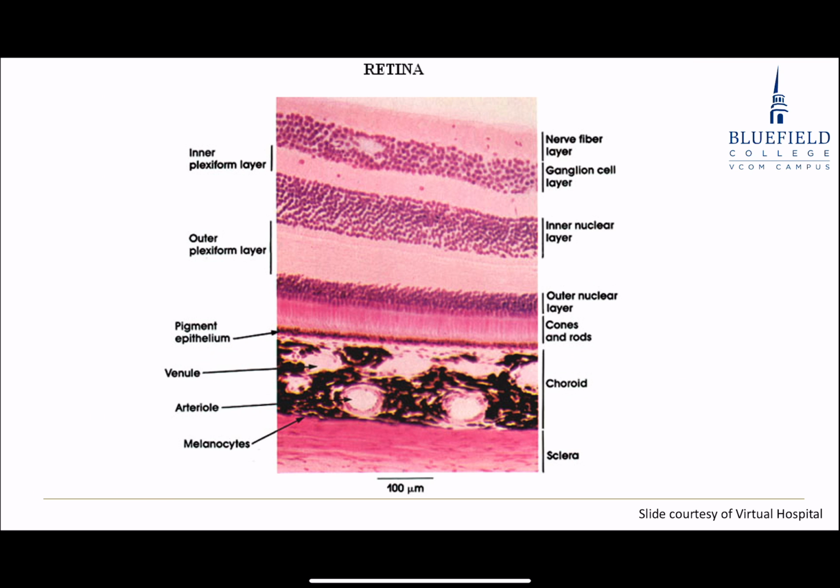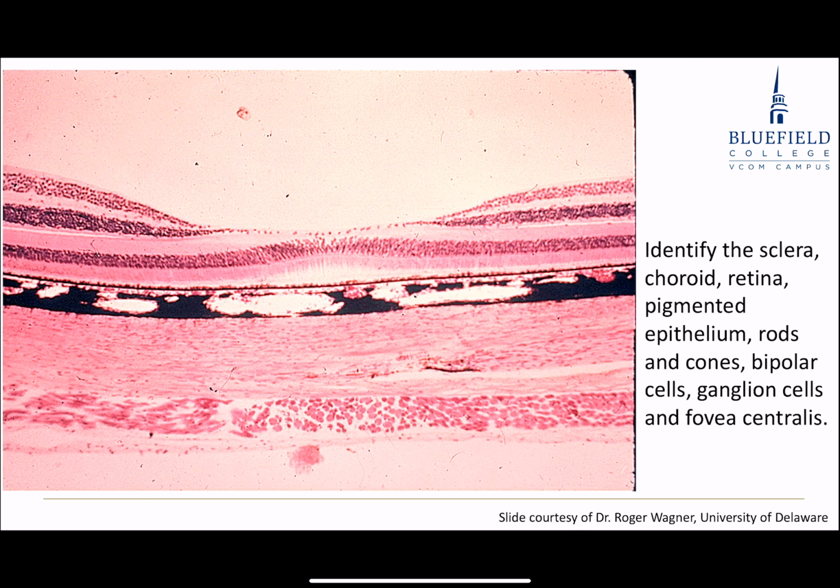All right, we take a look here. If I'm going along the surface here, I've got a little divot into the surface, don't I? Got a little divot in the surface of the retina, and I know it's the retina because here's my choroid right here. Sclera out here. This would be extraocular muscle that moves your eyes out here. But if I've got a divot coming down, a dimple coming down within the retina, it could either be the fovea centralis or it can be the optic disc.